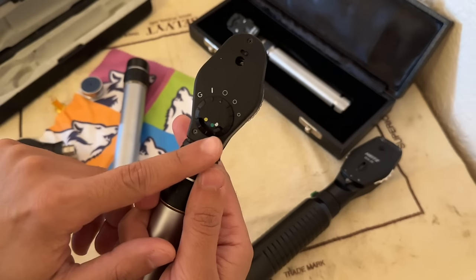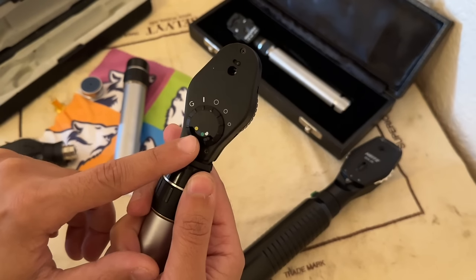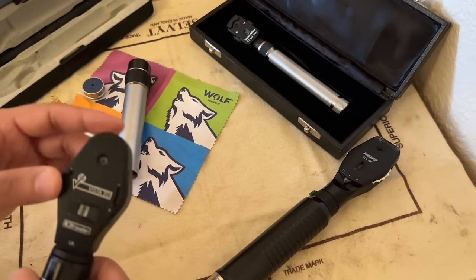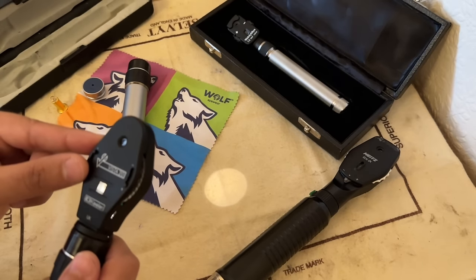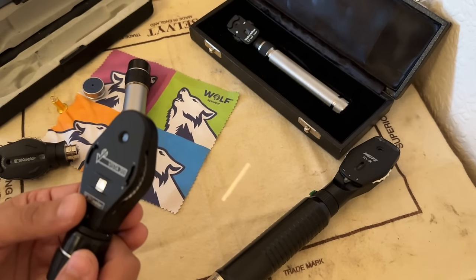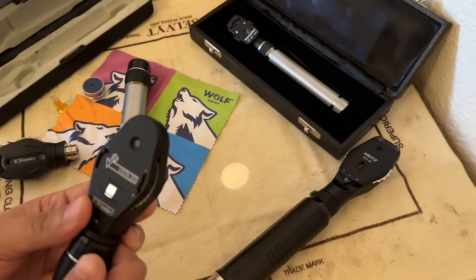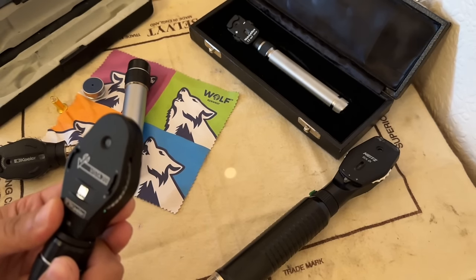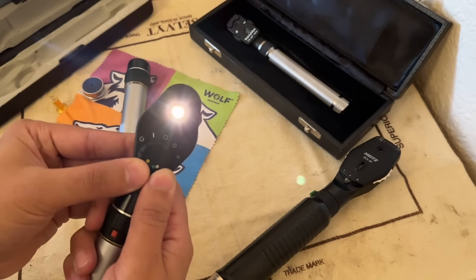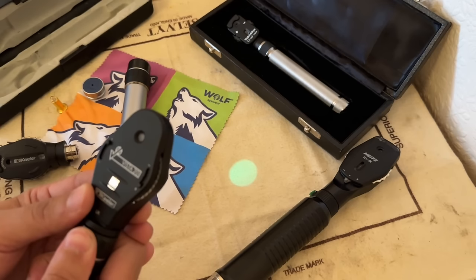Protective window. And here are some of the filters that come with this model: you have your yellow light, cobalt blue, red free, and standard white. So let's have a little look at this one in action. That's your standard round large aperture. You have your slit, target, medium aperture, small aperture and smaller aperture for looking at the macula. And if we pop a filter on, we have all the same apertures but now in red free filter.